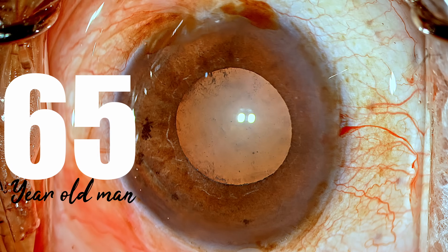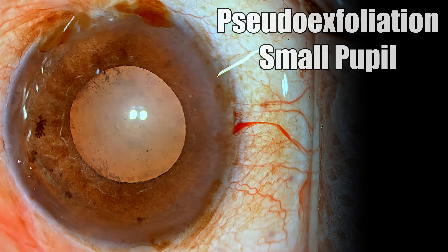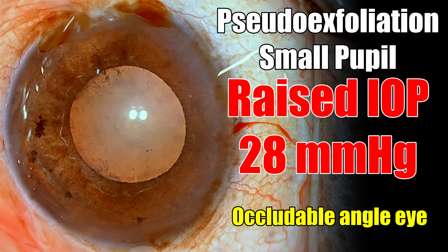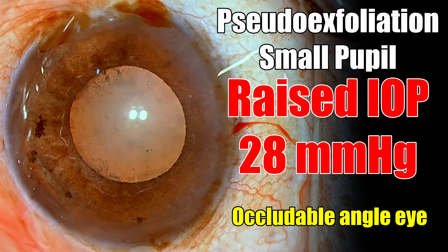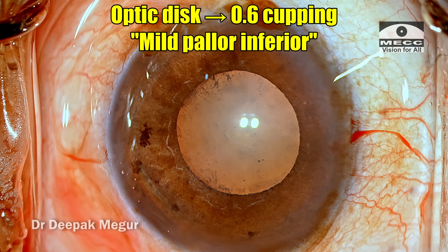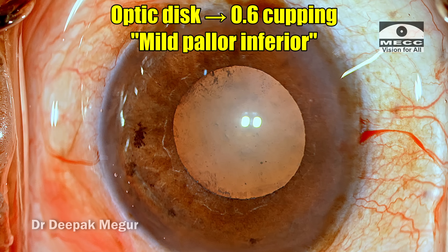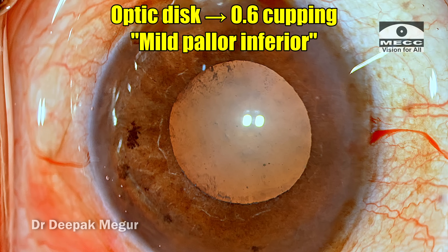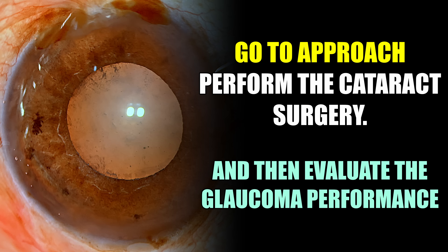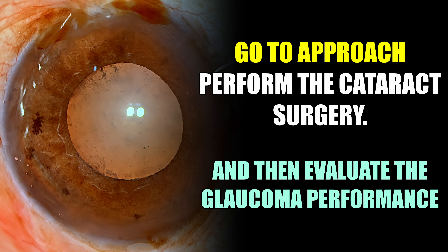She is a 65-year-old lady who has got pseudo-exfoliation. Her pressures are slightly up. The angles are occludable. Her IOP is around 28 without any medication and the optic disc is showing about 0.6 cupping with mild pallor in the inferior NRR. In this case, my approach is to perform the cataract surgery and then evaluate how the glaucoma performs later on. Nevertheless, she's going to be on lifelong follow-up for the glaucoma issue.